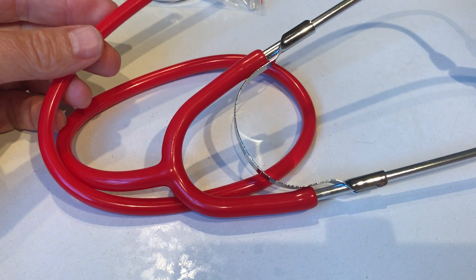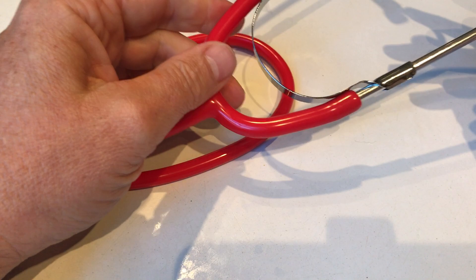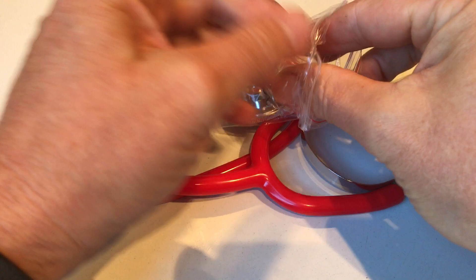What you've seen me do there is fit the tubing over the headset part of this unit. You push it nice and firmly — it can go right up. Try and get them certainly matched on either side, because that's going to reduce the tension on the actual tubing. Then it's just a matter of fitting the dual head.